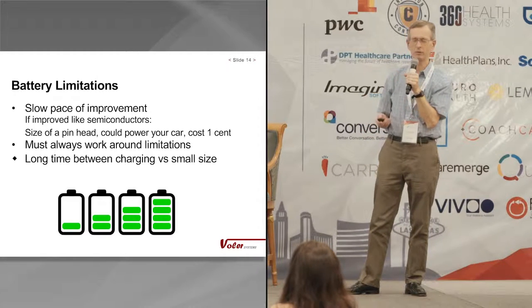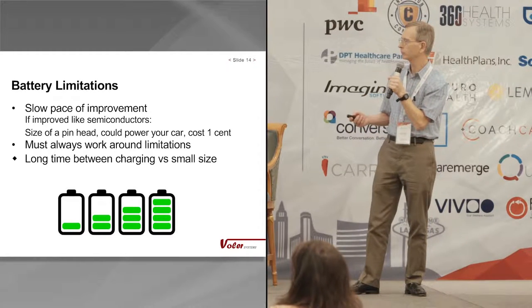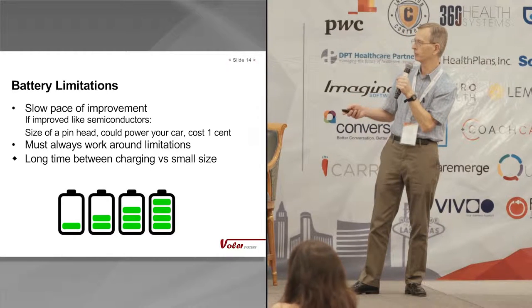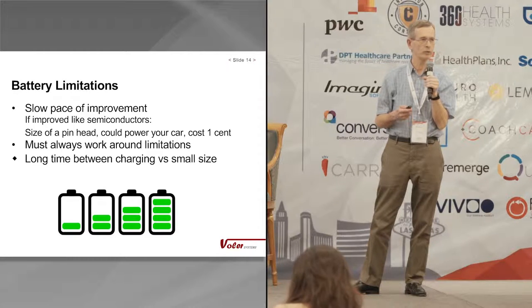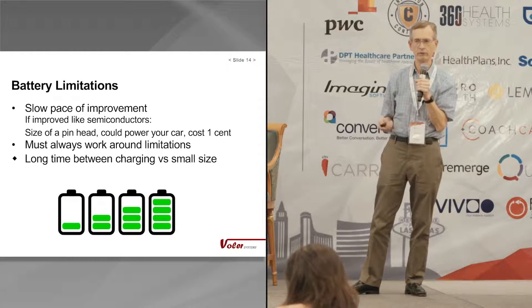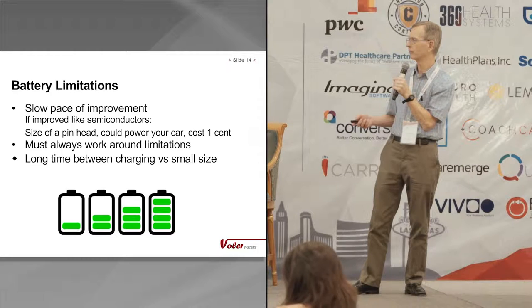The reason is that, I'll get to the reason in a moment. But so we're always working around that. And you have to deal with how long will the battery last, how often do you have to charge it, and how big is it?